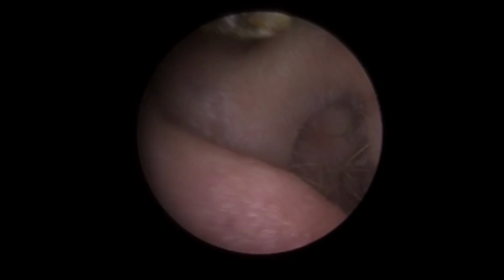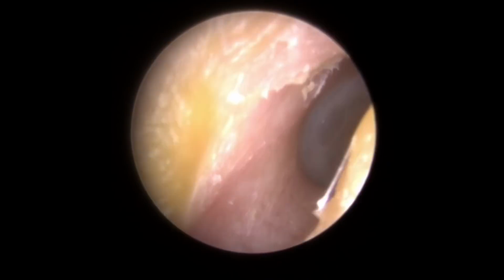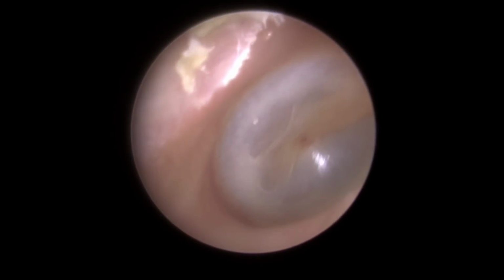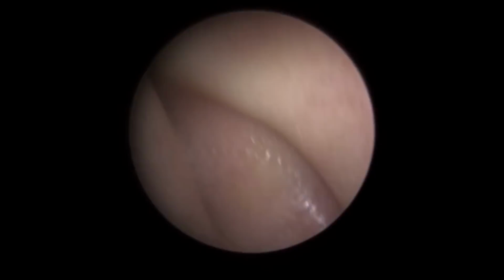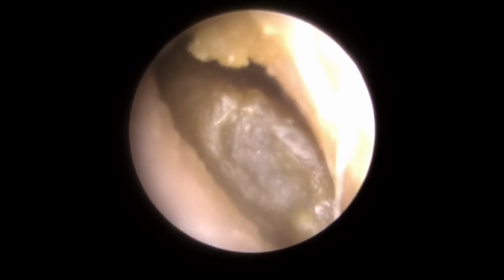I couldn't even get the hook. It was that hard. I couldn't get the hook into it to lift it out the canal. So that's why we did it with the Zollner tube there. You can see the eardrum there. A couple of air bubble outlines in the centre. Just a little bit of air stuck to the back of the eardrum. It's quite common, especially in these winter months as well.